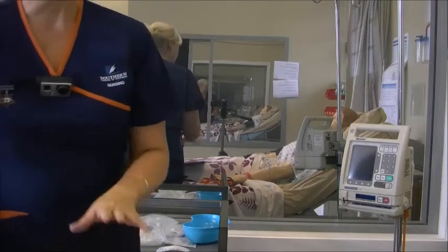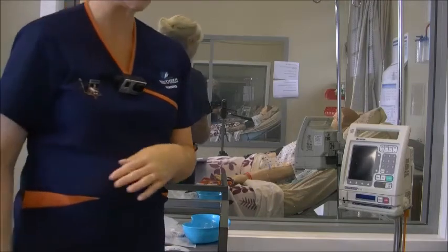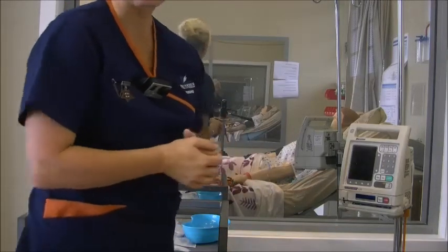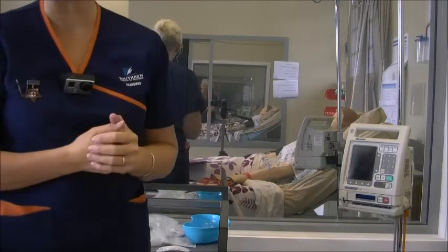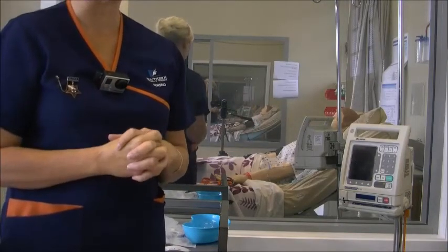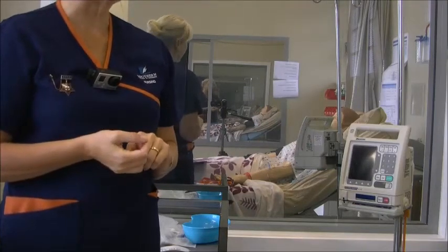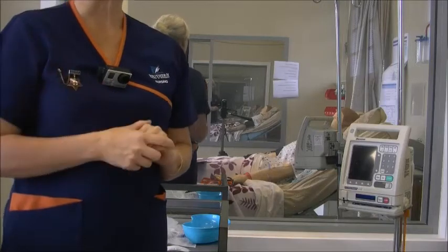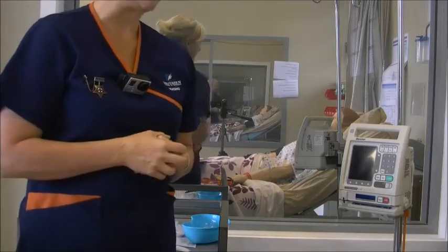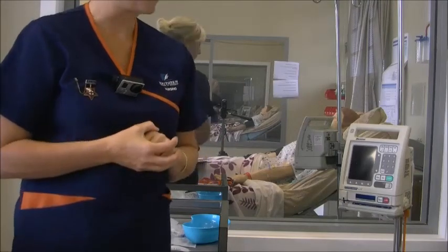So again, I'm going to check my patient's details, so the medication chart with his name band, and I'm going to confirm to him that it is George and that he has the right date of birth and the right NHI number prior to me setting this IV fluid up. Remember, when you do this, you'll need to be checking it with your RN. So the tutor that's assessing you on the day will be that person for you. She will check, or he will check the IV solution for you and do the double signing.